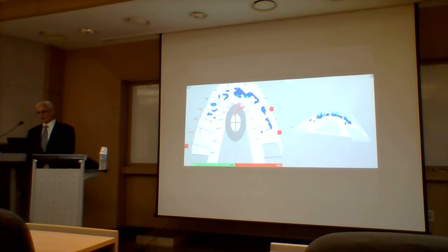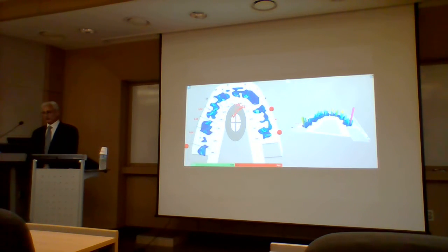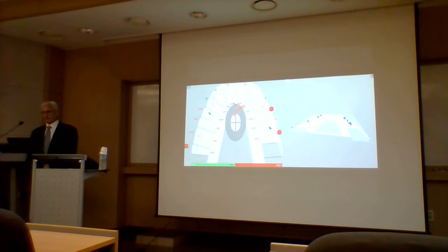And you'll see the anterior is overloaded, the right implants are overloaded, and the left implants actually are pretty good. They come together late. I can play that again. Watch the timing carefully: the implants on the right make contact first, and the far back on the left is still not touching. Stop. I apologize.